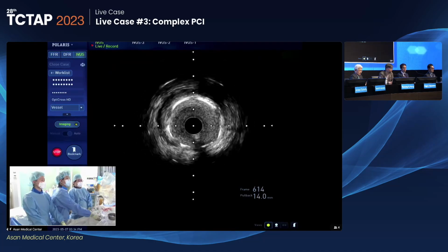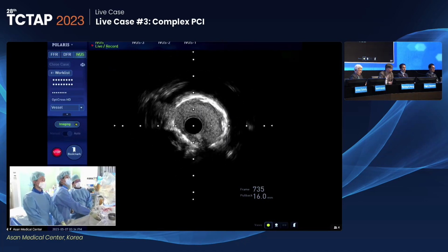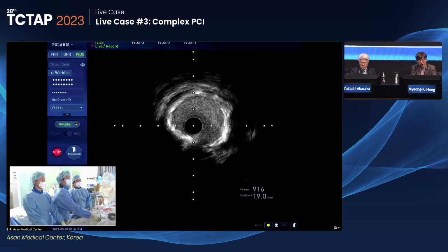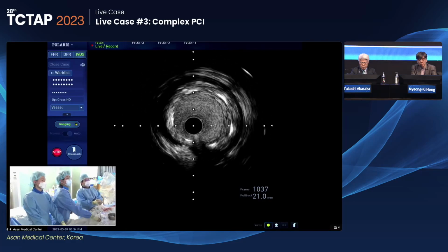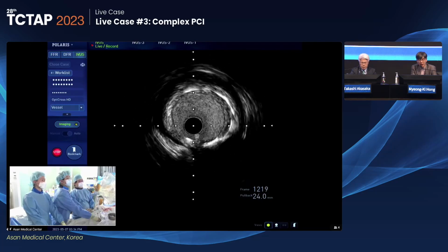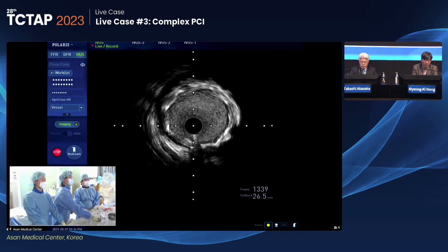It may be associated with some kind of positive remodeling after stenting. Another reason for the small vessel size distal to the stent margin is that the flow is impaired, with a little bit of shrinkage. So that IVUS finding is not the real situation.